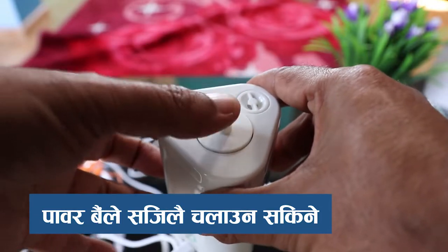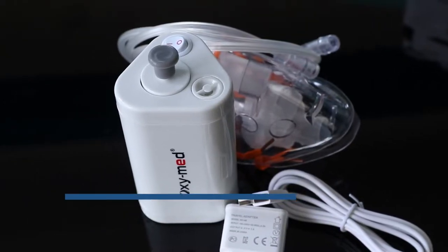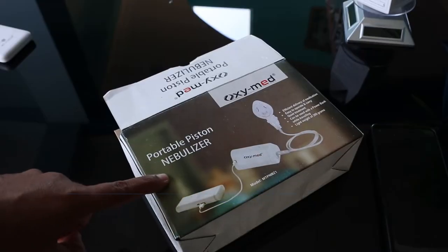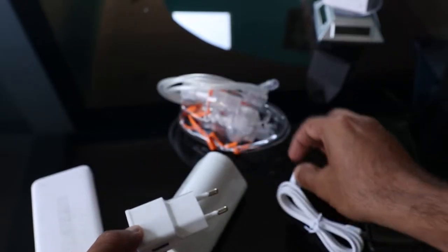The Nebulizer is a great deal. The power adapter is also a great deal.